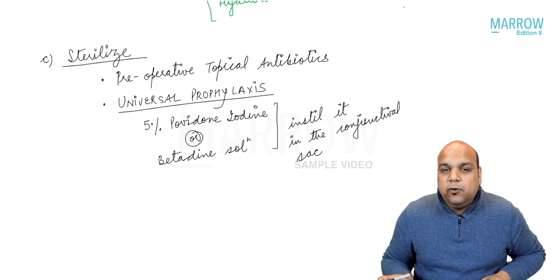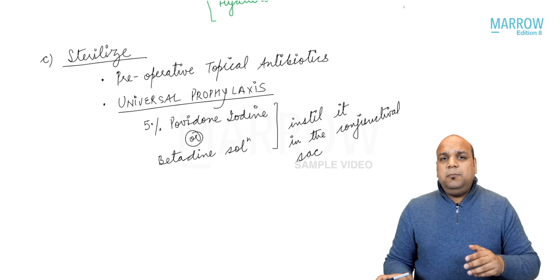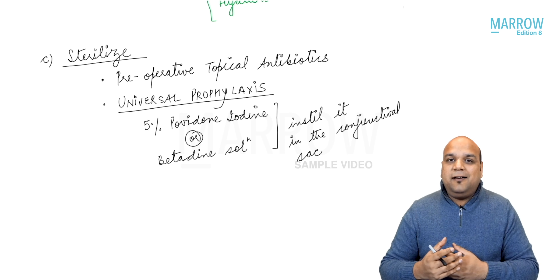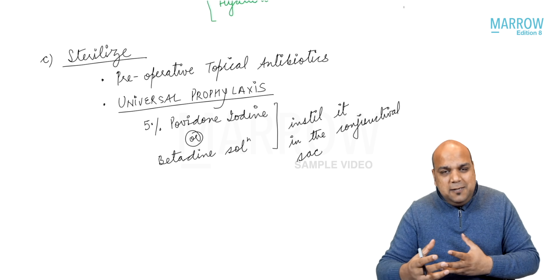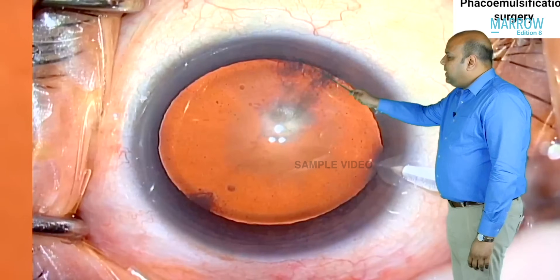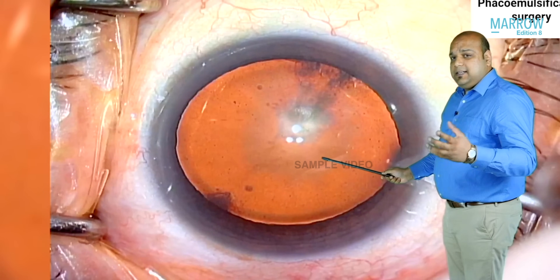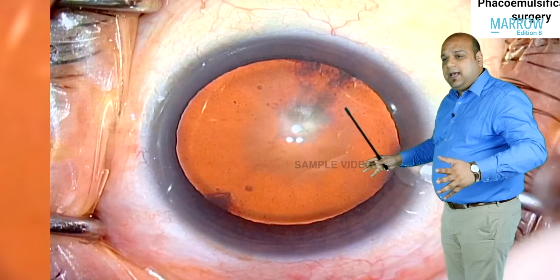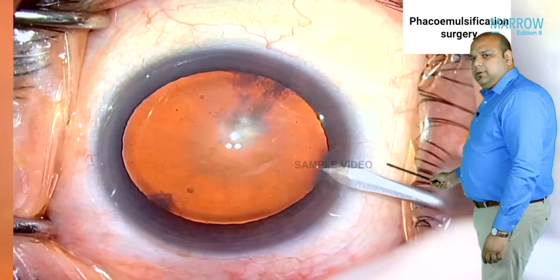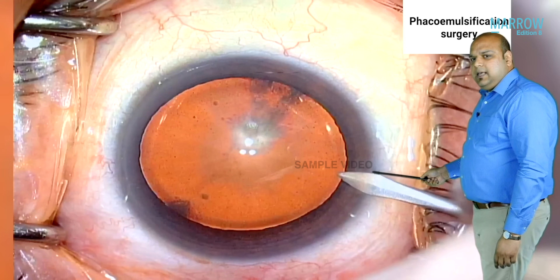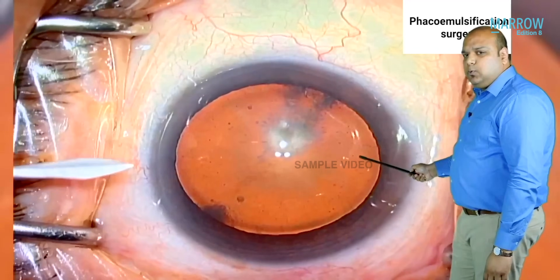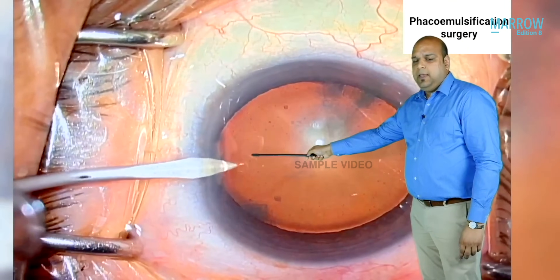Once the patient is prepared and in the operating theater, we begin the surgery. Let us now watch a video of phacoemulsification to get a better understanding of the intraoperative steps. We can see the pupil is fully dilated to give a field of view and field of surgery, since the lens is behind the pupil. As the first step, an MVR blade creates a clear corneal incision, and the surgeon creates two side ports or side incisions.